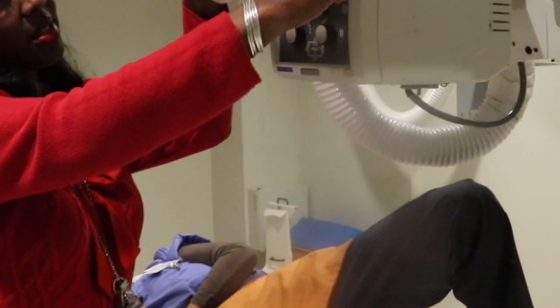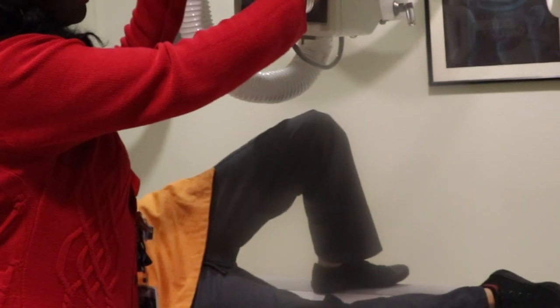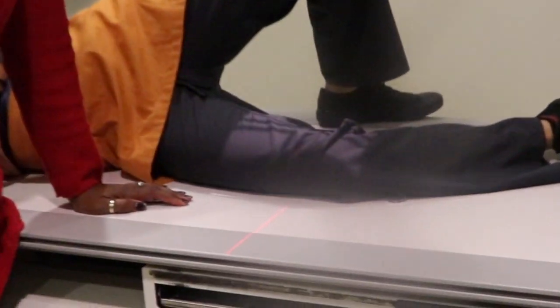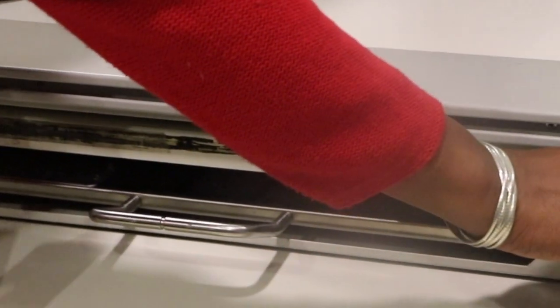It's very slight. Go 7. Notice the difference in where my central ray is now. Whenever you put the angle on, look back at it, because notice the big change once you put an angle on the central ray. Make sure you set it.